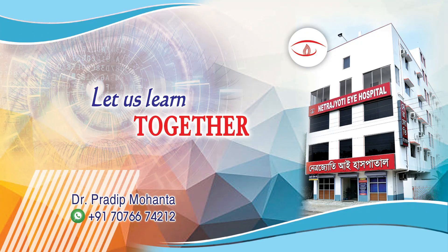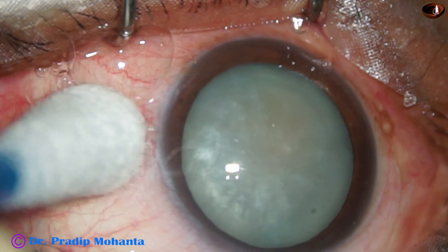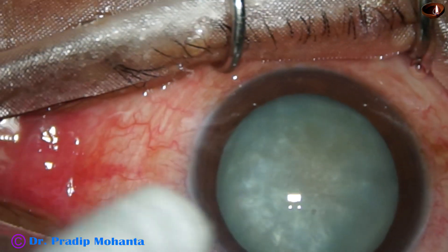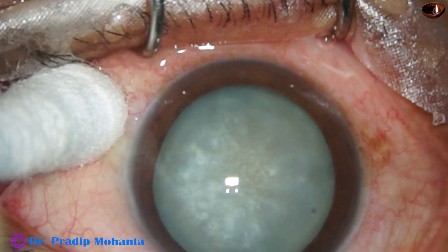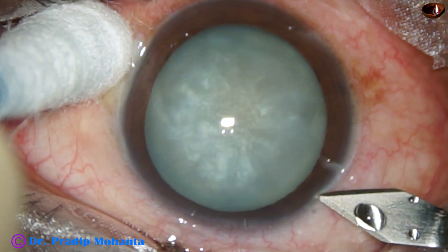Friends, welcome to my workplace at Ranaghat, West Bengal, India. This is an intermescent cataract while doing capsulorhexis — the rhexis ran out in this case. Let us see what happened and how it was managed.